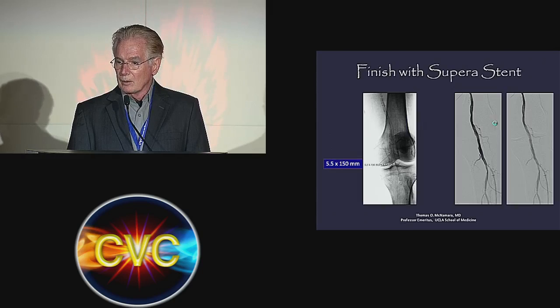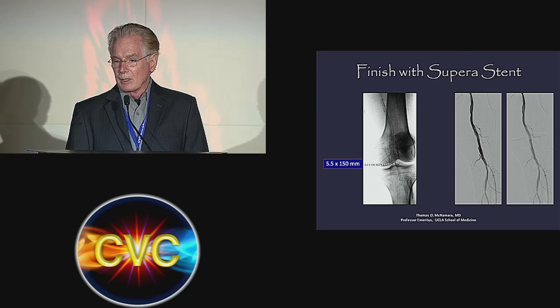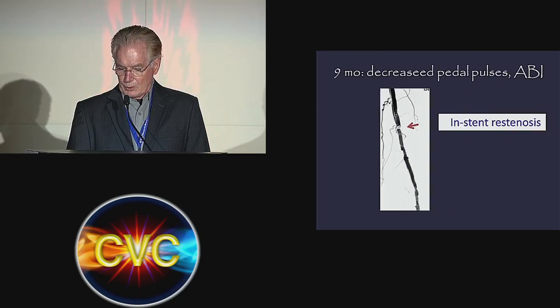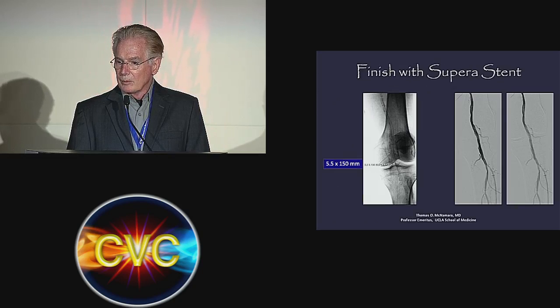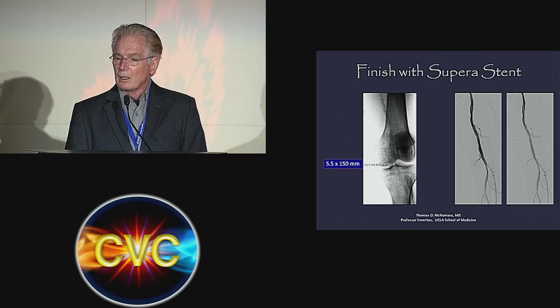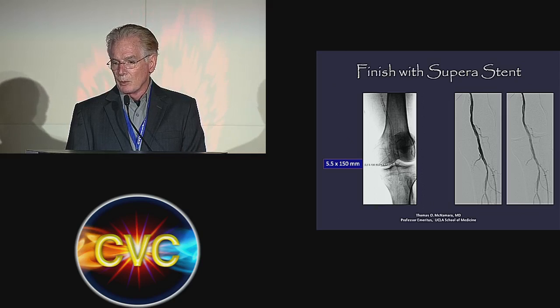At any rate, we went ahead, finished, wound up putting in a Supera, which has the reputation of being a great device for this area. We finished up, I beg your pardon, I meant to show you downstream. He was open, as you would expect, at the end, and his anterior tibial was nicely patent.